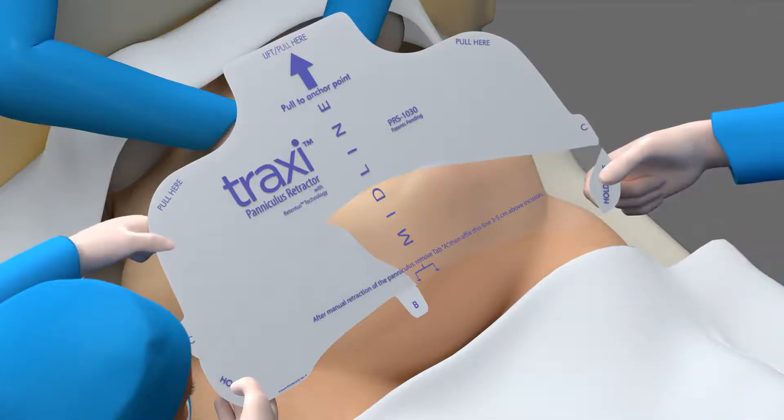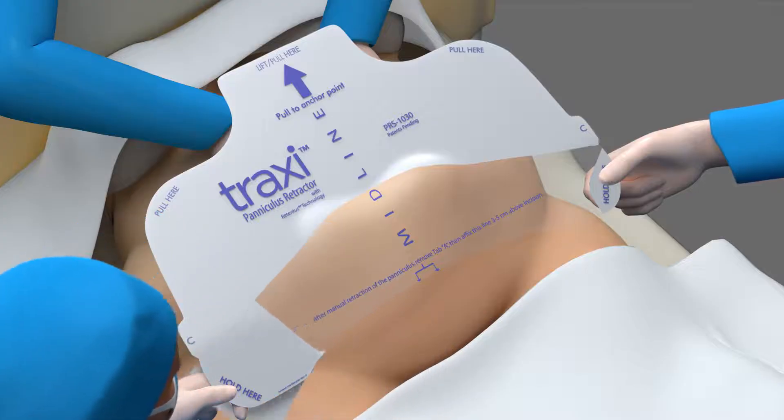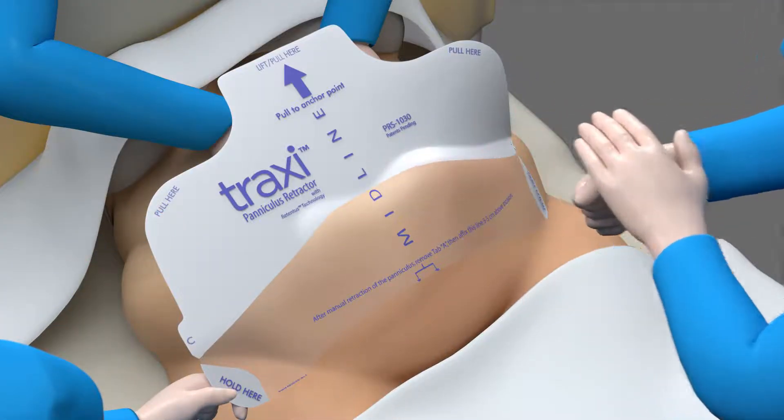Step 3: Remove the B panels. Apply tension on each side of the device during application while smoothing onto the patient's skin from midline out.